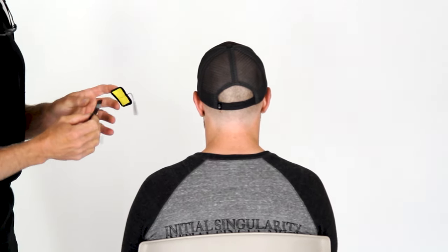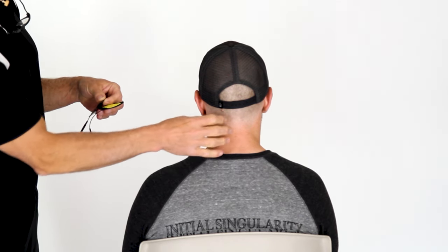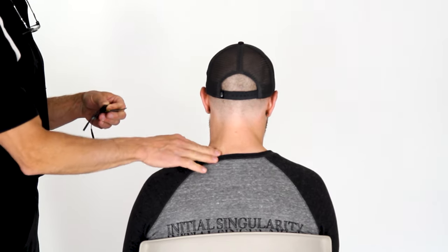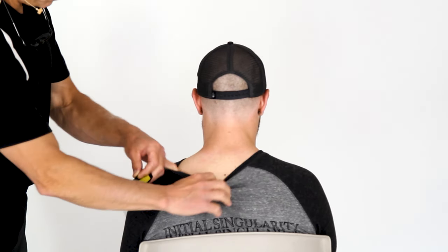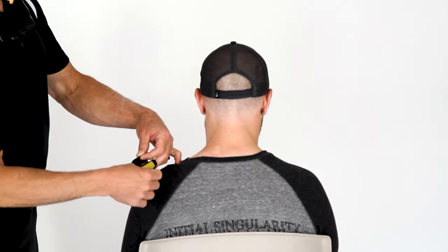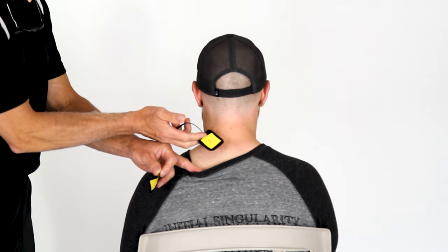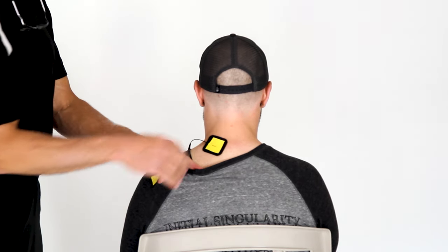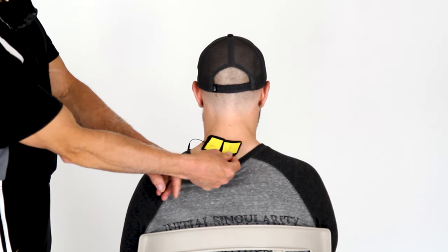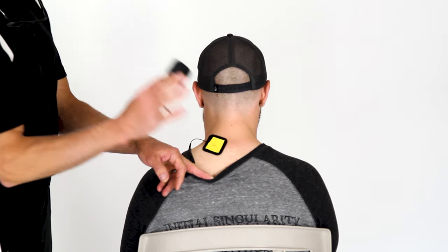Brad is going to start with channel one and show one-sided neck pain. The neck pain is typically found in the upper traps area. We're going to put the first pad right over the pain. One thing you do not want to do is put one pad right next to the other — if they're touching, that's too close. You also don't want to put a pad directly over the spine. Those are two no's.